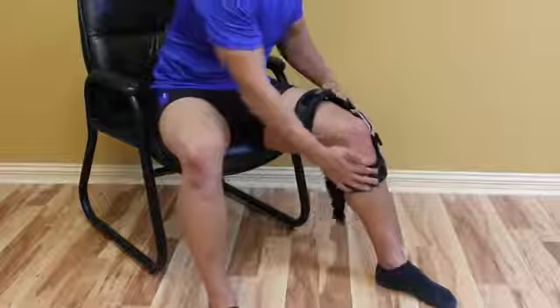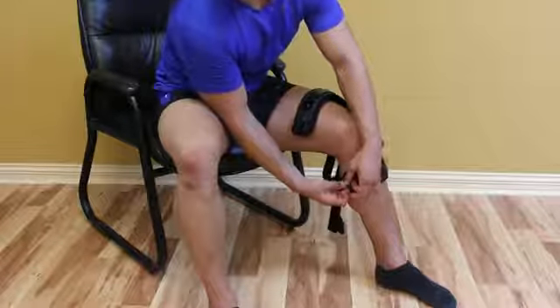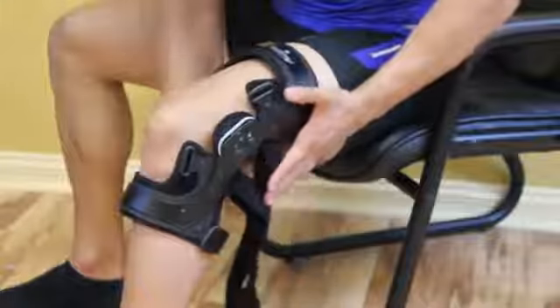Sitting on the edge of a chair, the brace should be applied with the knee at 75 degrees of flexion. Position the brace so that the center of the hinge is 1 inch above the joint line. When applied correctly, the center of the hinge should be level with the top of the patient's patella.